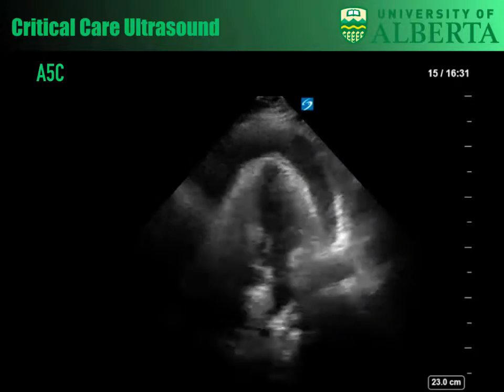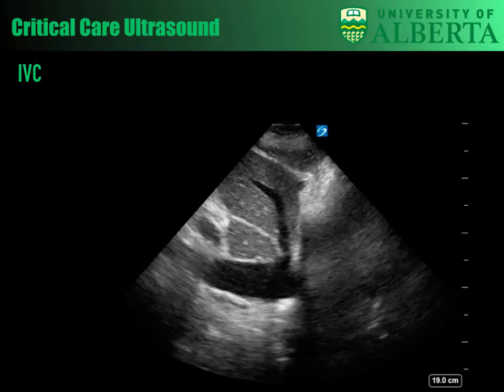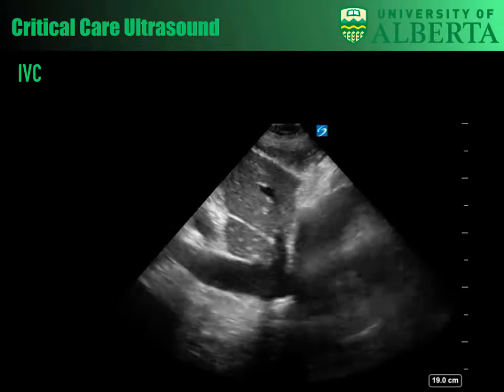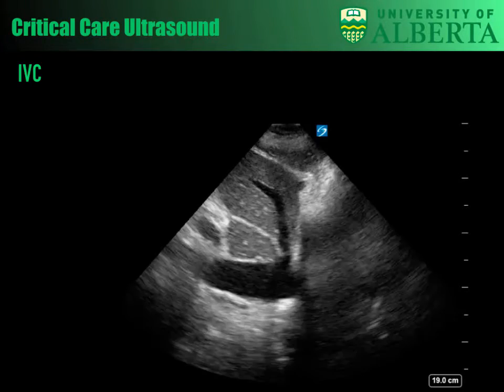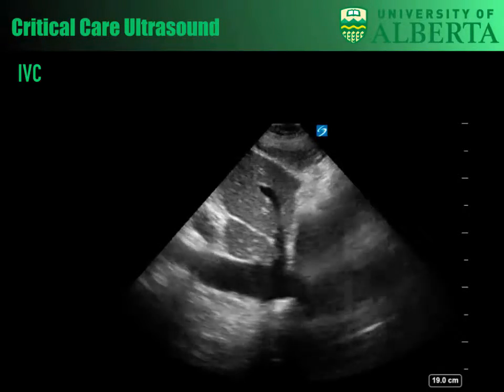And so in some cases you may not see this side very well, but when we see this it's obviously quite concerning. There's the IVC. It's obviously nice and juicy with not much change there, so minimal respirophasic variation. And this IVC measured around 3 centimeters. So again, we're seeing a bit of that stasis develop in the IVC, and there's a hepatic vein.